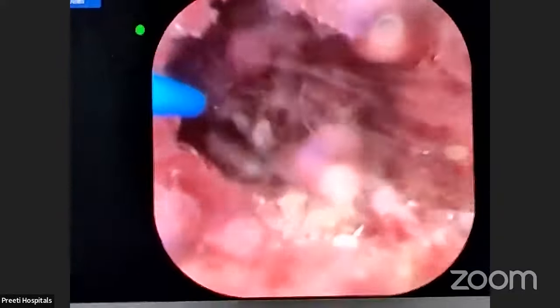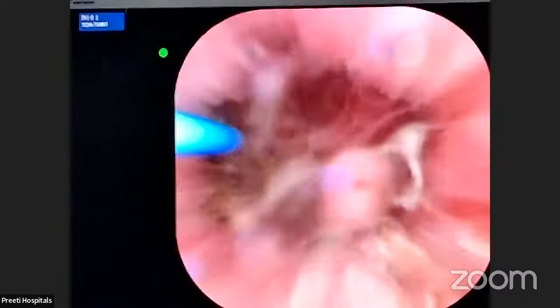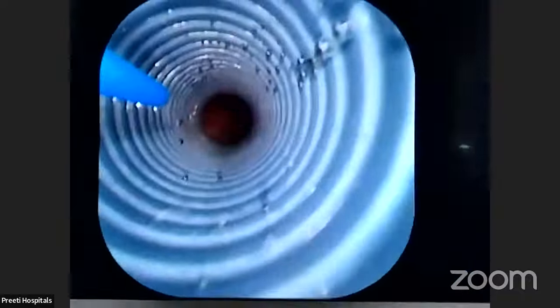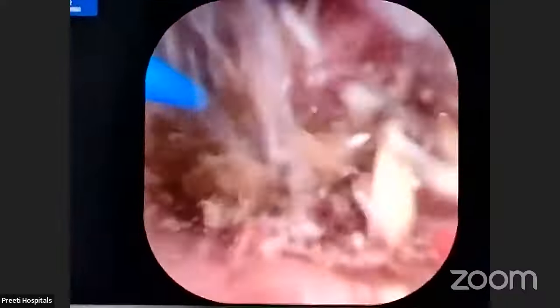Now suck it out. I'm lucky today that the sheath has gone. If the sheath had not gone, I might not have demonstrated this. See these fragments, how they are coming out. Come back in a tenth. How many times have I come back in this case? 10 times. That is very, very less for a 1.5 by 1.5 centimeter stone. Straight I am there. The easy case, the ideal case.